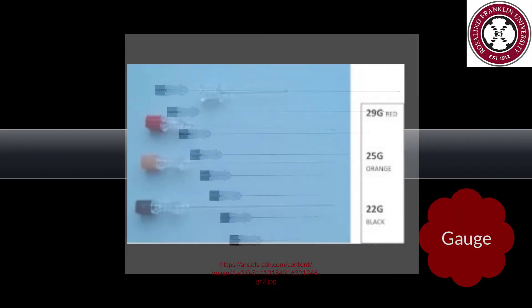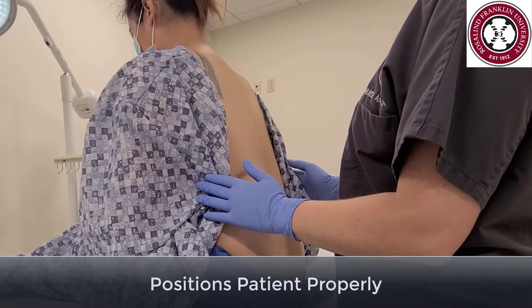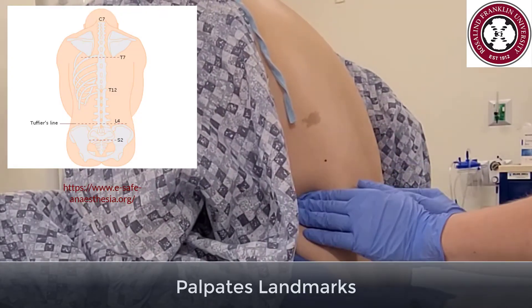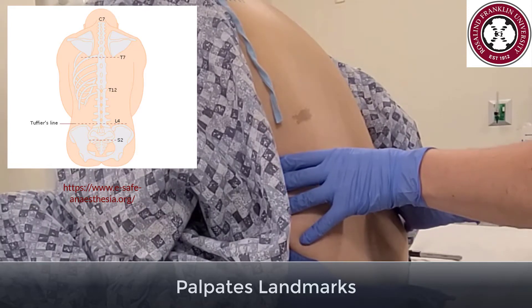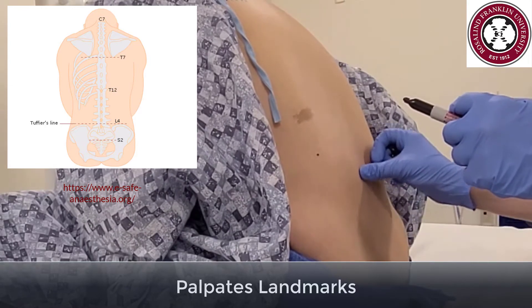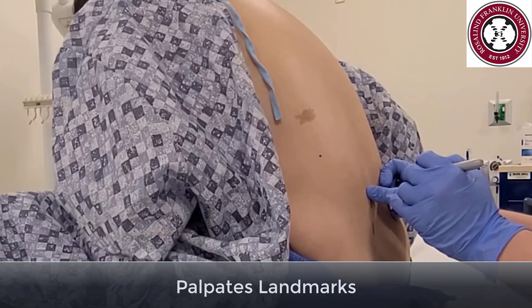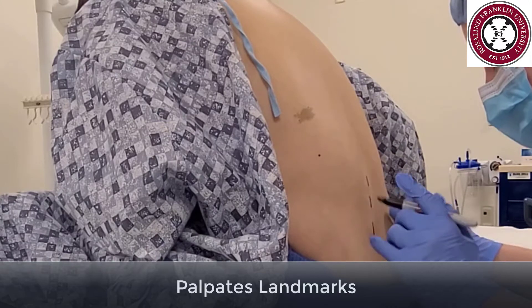The bigger the gauge, the smaller the needle and the less chance of post-dural puncture headache. Position the patient properly by asking them to arch their back like the letter C or an angry cat. Use the landmark of the patient's iliac crest to find Tuffier's line at L4. Use your hands to find the patient's spinous processes for midline and choose an interspace between two aligned spinous processes. If you are having difficulties, you can have the patient sit straight up and reposition, or if landmarks are difficult to palpate, ultrasound may be helpful.